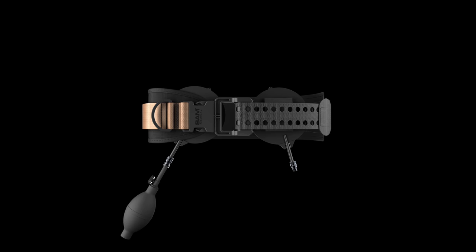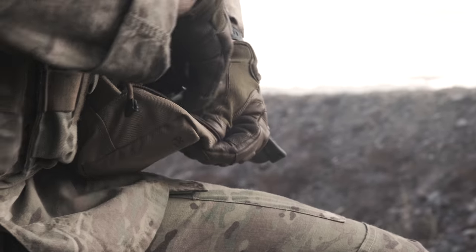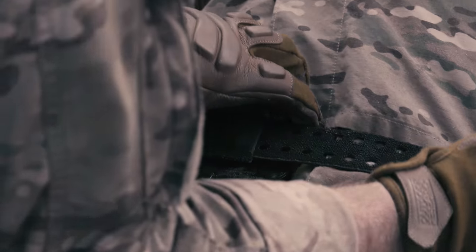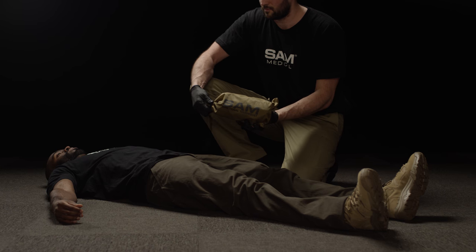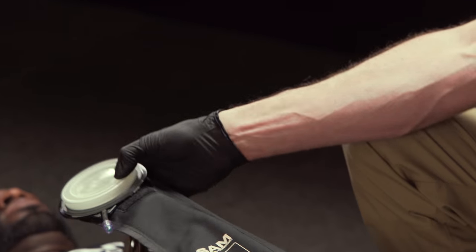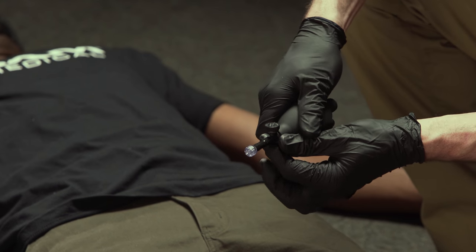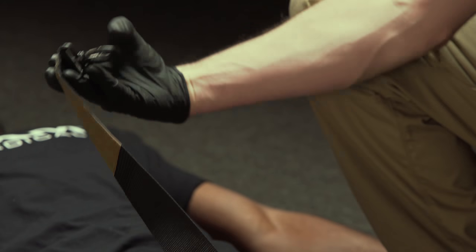This is the SAM Junctional Tourniquet by SAM Medical. The SJT, as it's also known, is made up of five components: a ruggedized belt that leverages patented SAM AutoStop buckle technology; an inflatable target compression device, or TCD; a second TCD with an attached extender; a hand pump to inflate the TCDs; and an auxiliary strap to control junctional bleeds of the upper extremity.